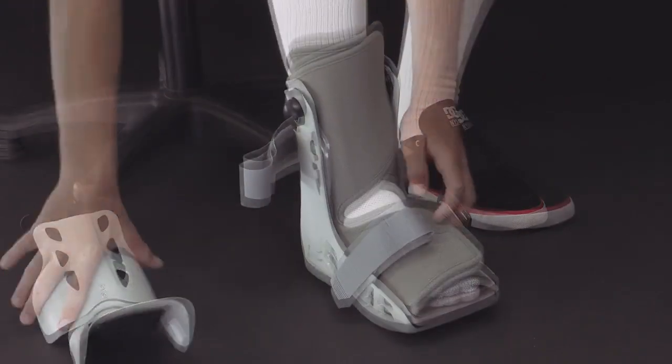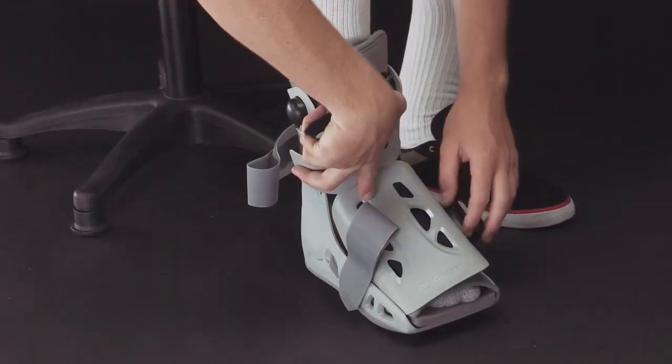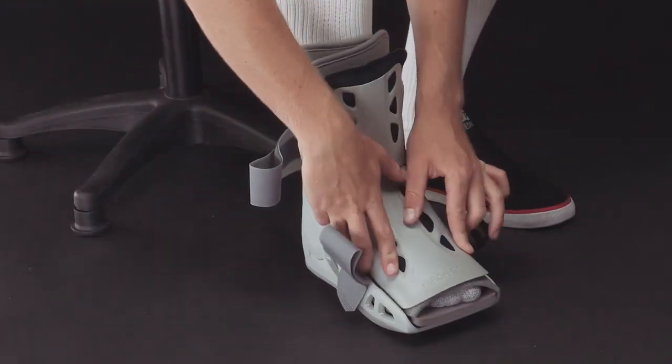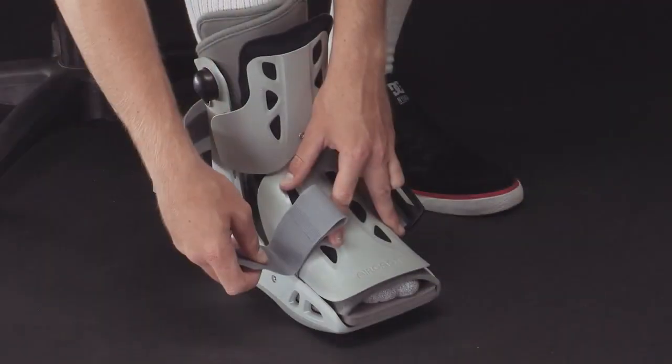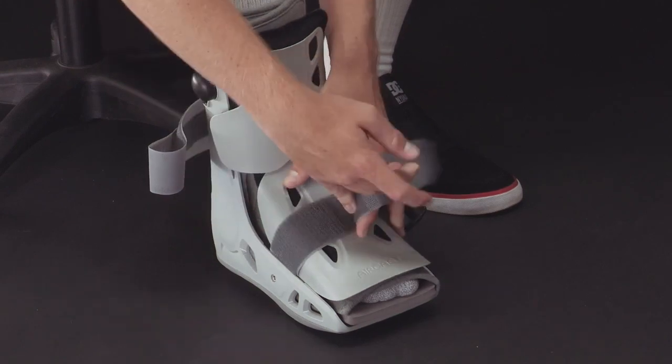Next, replace the front panel. Position the front panel so that the AirCast logo is over your toes and the foot panel is situated inside the boot. Secure the upper part of the panel outside of the boot.